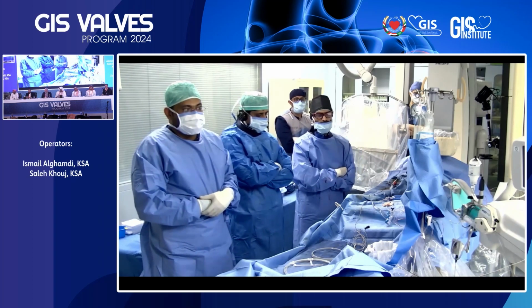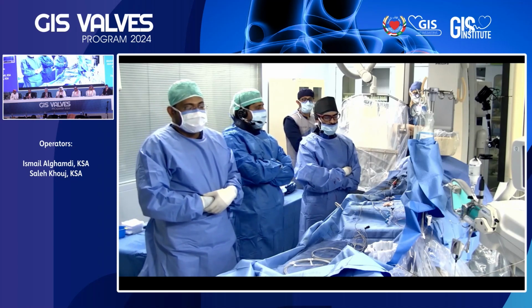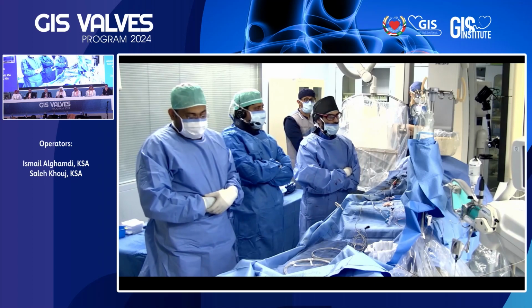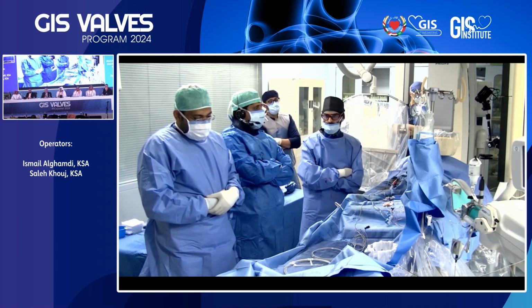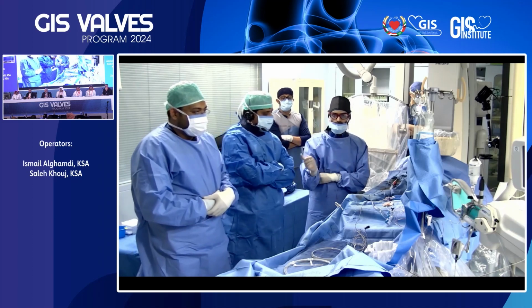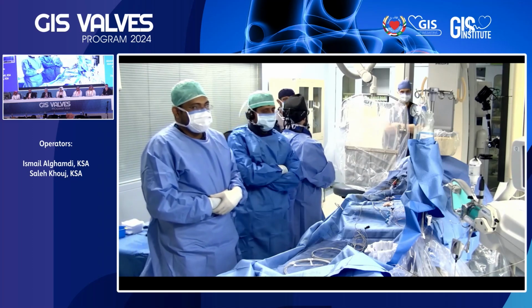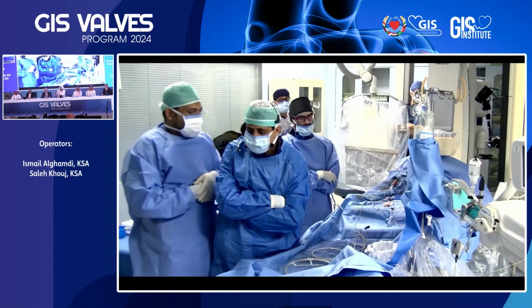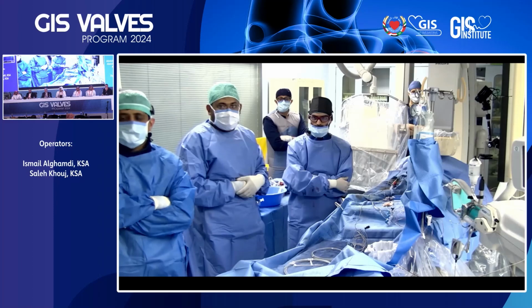Yes, sure. Assalamu alaikum wa rahmatullahi wa barakatuh. Thank you for having us. I would like to thank GIS for this kind invitation, and thank you, Dr. Fawad and Tayri. Let me introduce the team. On my right-hand side, Dr. Ismail Al-Ghamdi, Dr. Ahmed Bawadir, and Dr. Ahmed Fadil, our cardiac anesthesia, and Malik, who will be preparing our valve. Dr. Ismail, please present the case.